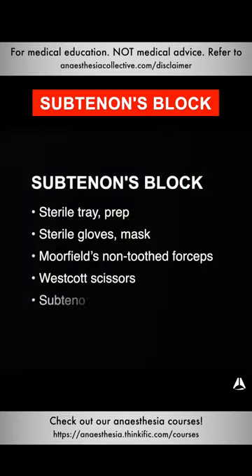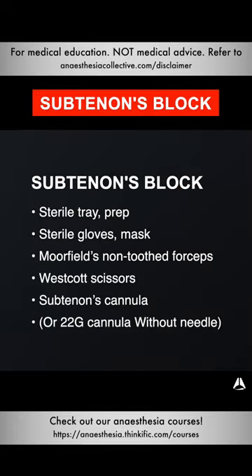All you need for a subtenons block is a sterile tray, sterile gloves, and the appropriate prep — really just a few pieces of equipment, including a subtenons cannula, the Morphil's non-toothed forceps, and the Westcott scissors.